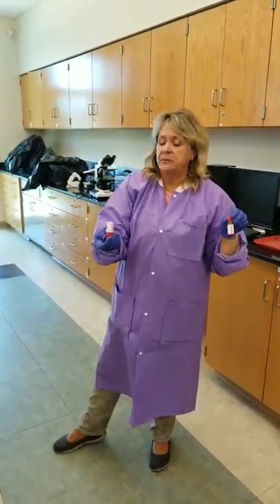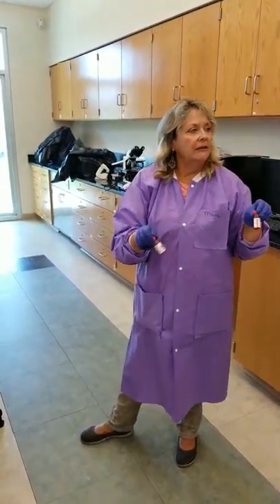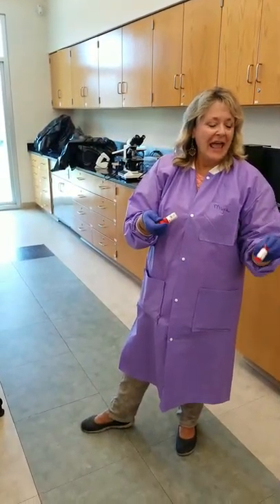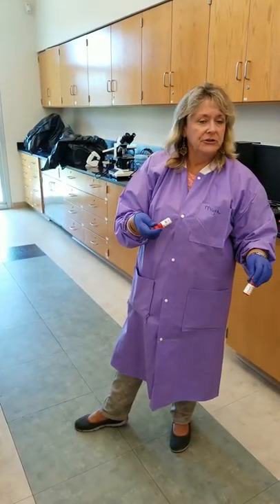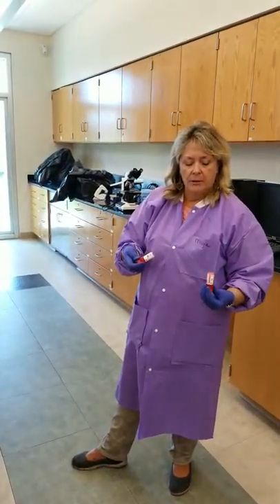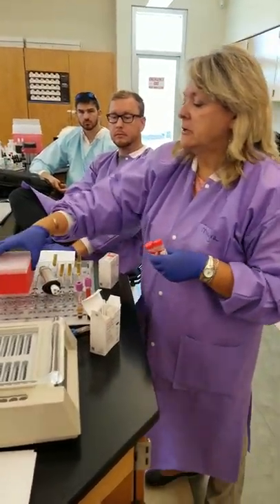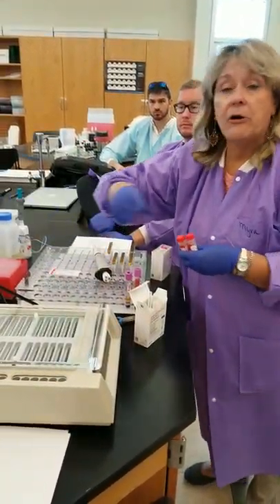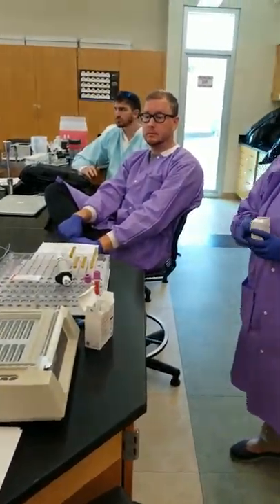Now, the one thing that you're going to be real happy to know is there's no washing involved in this system, and there's no check cells. Everything gets hung up in the polyacrylamide gel, so you don't have to do that. When we first went from tubes to the gel, we always felt like we were forgetting to do something because there are fewer steps. Okay, so that is my A and B cells.